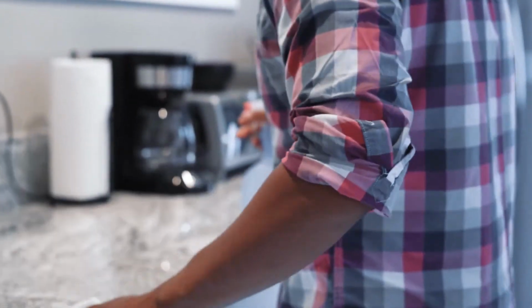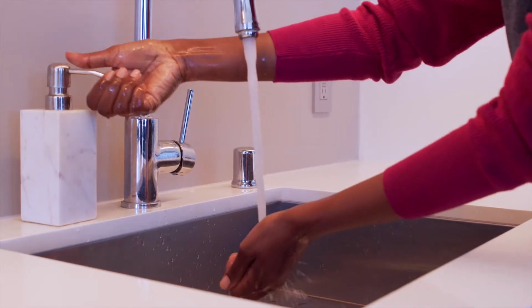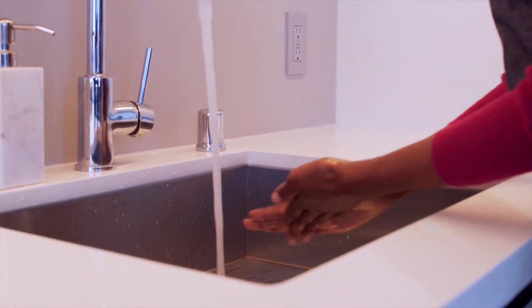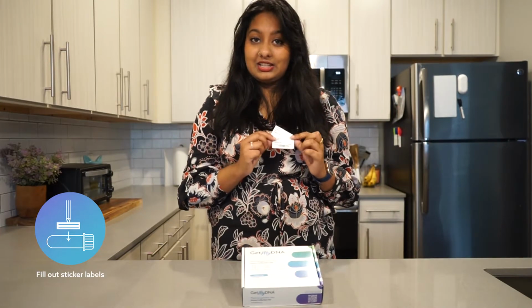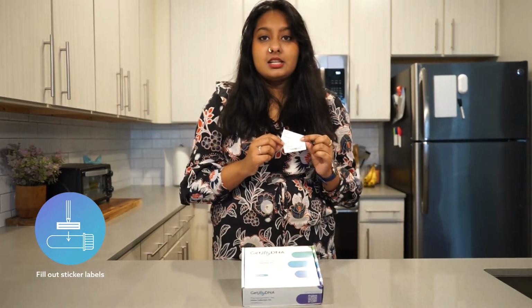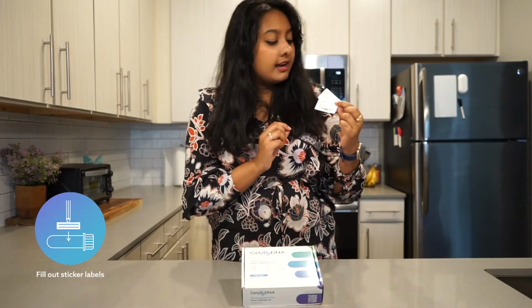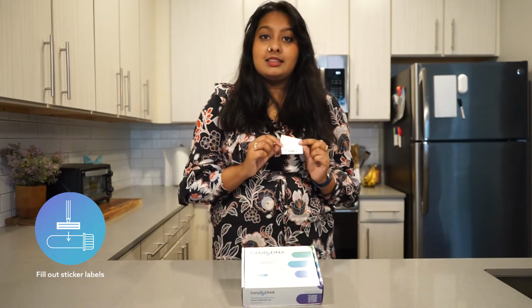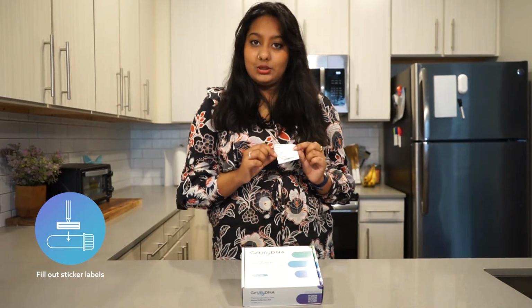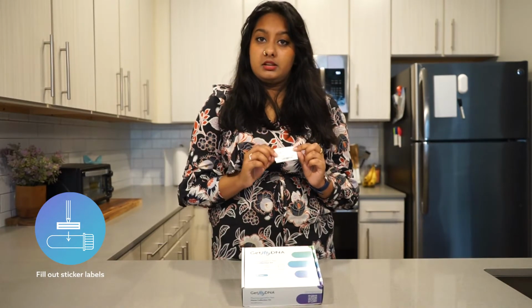To begin collection, it's recommended that you disinfect your collection space and wash your hands with warm water and soap for at least 20 seconds. Your kit includes 2 identification sticker labels. Fill out each sticker label with your name, date of birth, and collection date with a black or blue ink pen. Please write legibly and let the ink dry before applying on the tubes. Then take your sticker labels and apply them to each tube vertically.